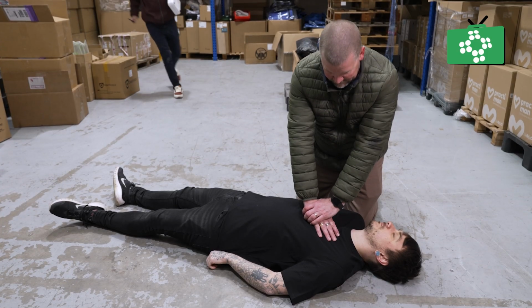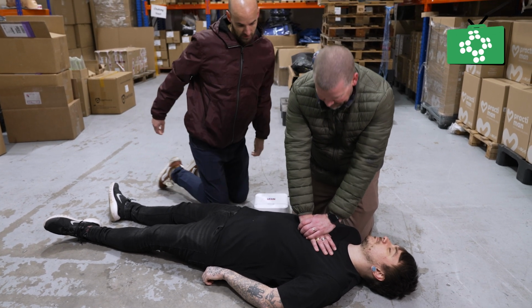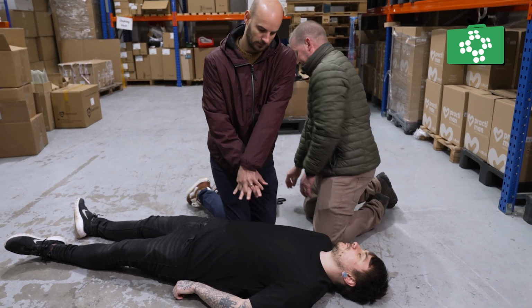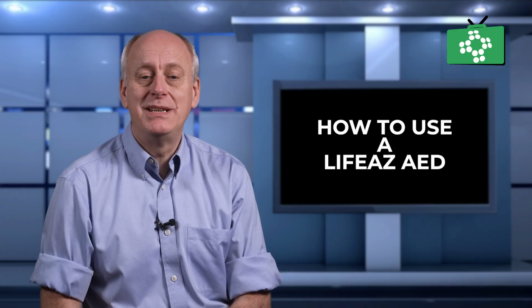Once the AED arrives, you'll need to get it onto the victim as soon as possible. If someone is there, ask them to continue CPR while you get the AED ready. This will help ensure that oxygen-rich blood is circulated to the body. Turn it on by pressing the power button to activate the voice prompts.